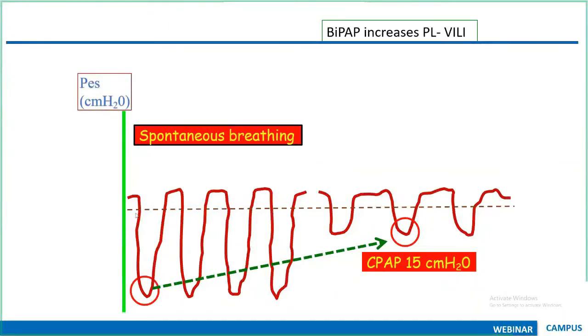So NIV, as you know, we have an IPAP and an EPAP. Here in this patient, you can see a huge tidal volume. So there will be an overstretching of lungs because of this significant respiratory effort. If you connect this patient to the NIV, they will be generating huge tidal volume, more than 700 or 800. This will cause an overstretching of lung fields, and that will produce something called PSILI, or patient self-inflicted lung injury. So you have to prevent that overstretching.